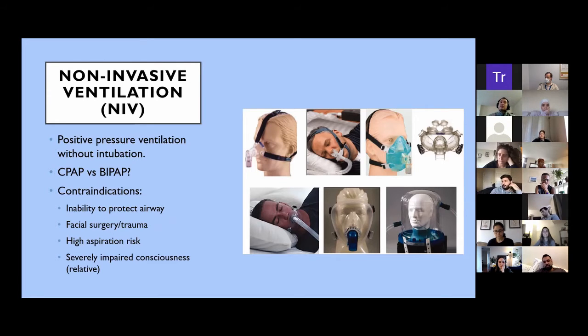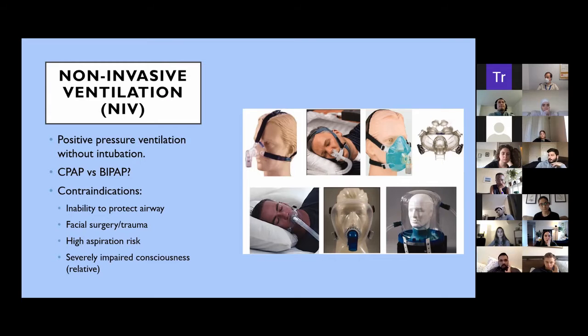In a similar way, if you have a patient with a narcotic overdose and the patient is kind of apneic, and you want to use Bipap in the meantime while you start a Narcan drip to fix that narcotic overdose, again it makes sense because you are bridging to something. But if you have a patient with impaired consciousness because of a benzo overdose, a stroke, or hepatic encephalopathy, putting Bipap on that patient and hoping that the patient will get better is wrong. The right thing to do is that the patient would need to be intubated.